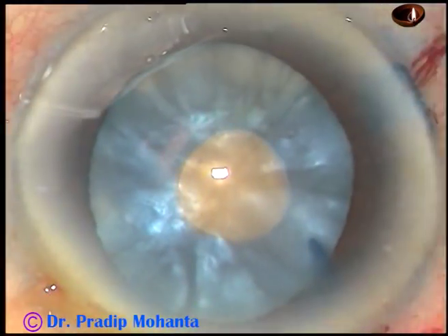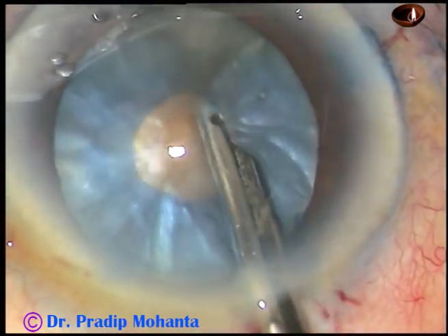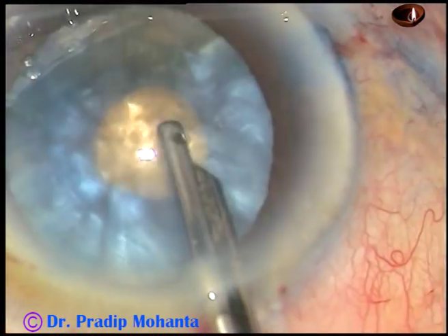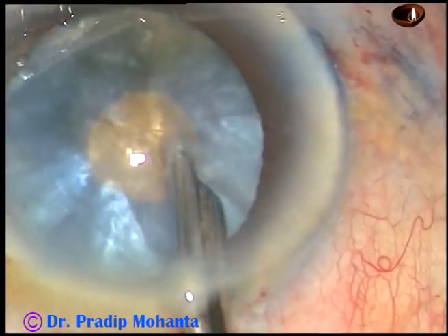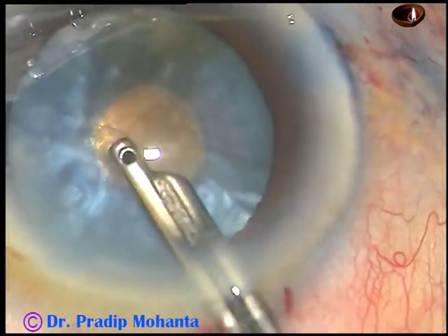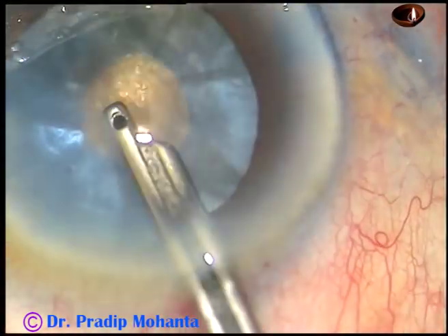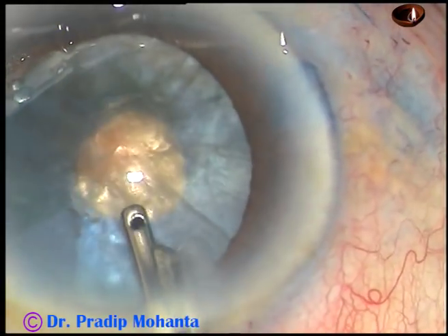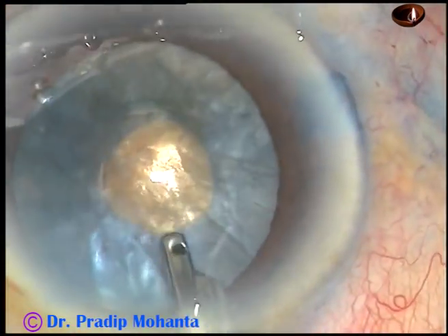Now I want to decrease the intralenticular pressure drastically. If you don't have this very simple instrument — a 23-gauge Simcoe cannula in your trolley — use your bimanual irrigation-aspiration and remove some cortical matter. As you remove this cortical matter, the intralenticular pressure decreases drastically and the cataract behaves completely differently. That's it.